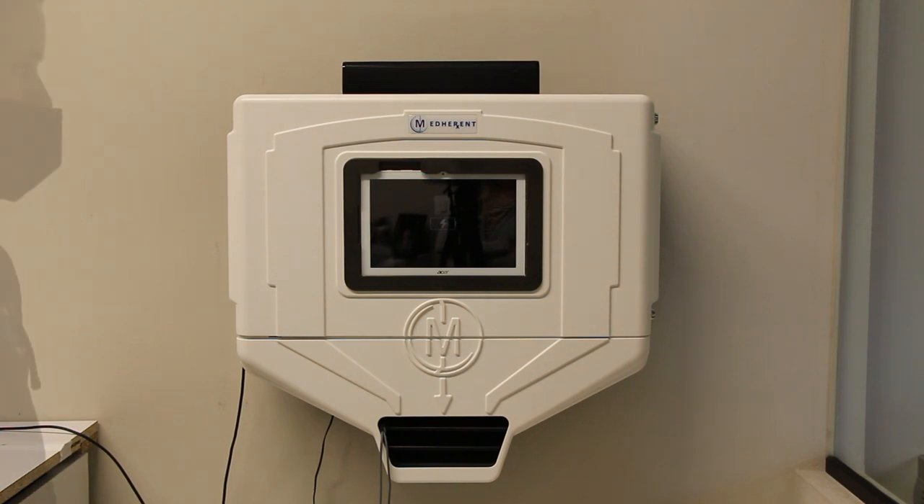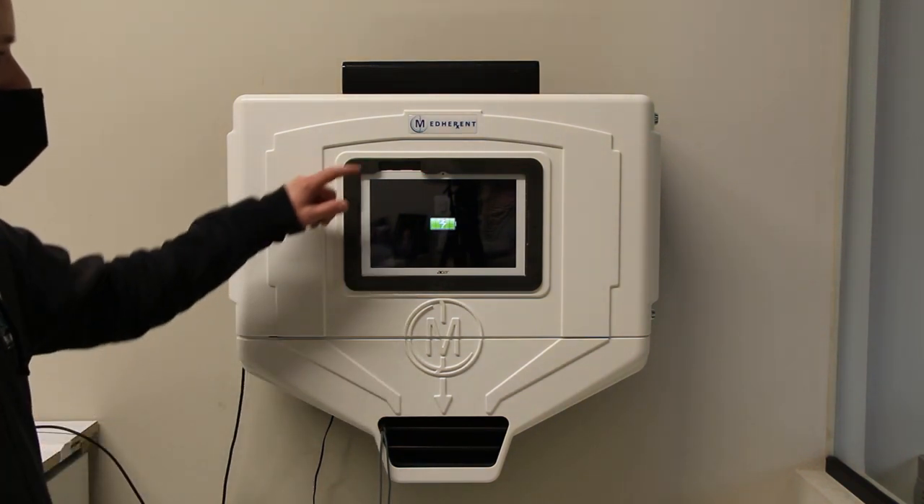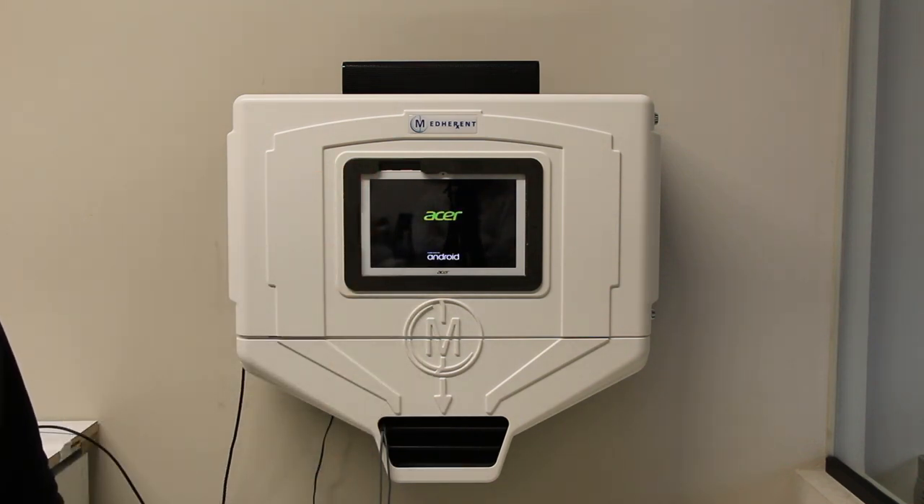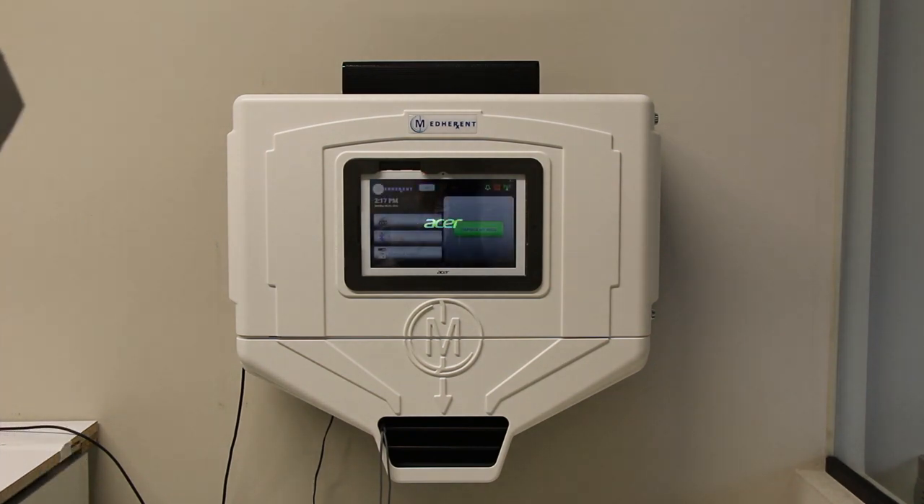The screen should now read 'Shutting Down.' Once the power to the screen has turned off, you should see a battery icon in the center of the screen. When you push the power button to turn the screen back on, make sure you hold it down until you see the Acer logo, which will then be followed by a couple of additional startup screens. Within a minute or so, the MedHerent home screen should appear.